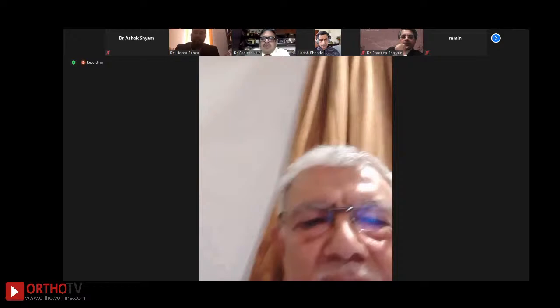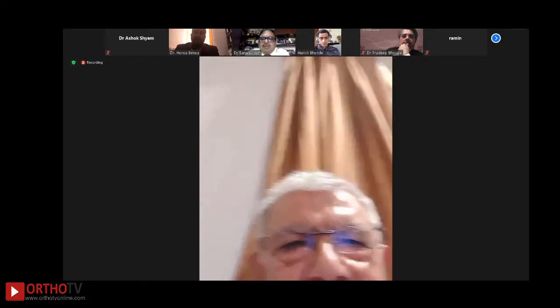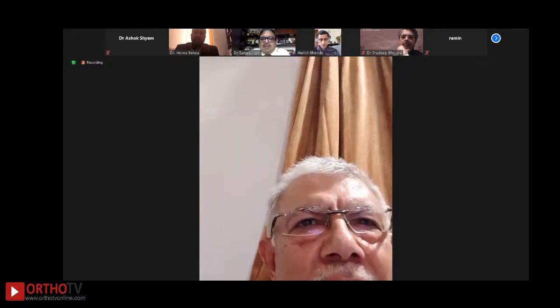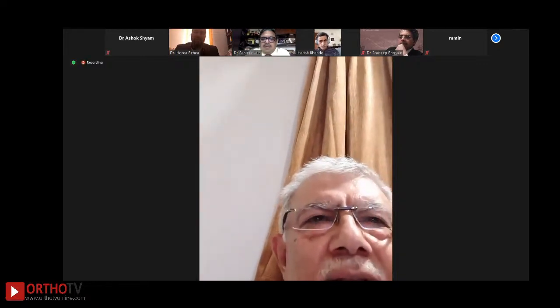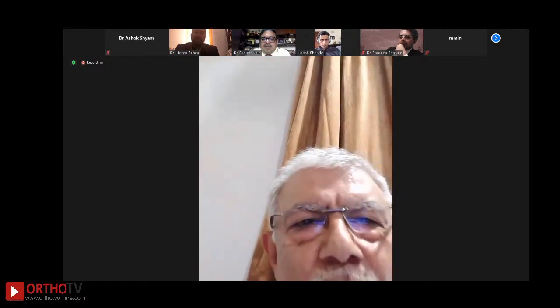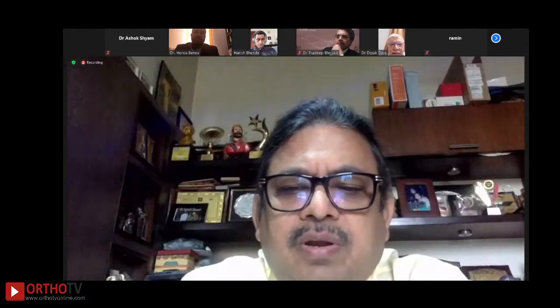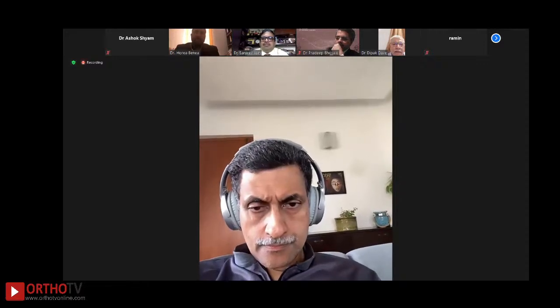I think, Dr. Sanjeev, your short message for the dual mobility, what we discussed here, is there are very specific indications for that use. It is really a useful thing, but not to be used as a marketing tool in young people just to get the range of movements. Absolutely right. I think that's the message.